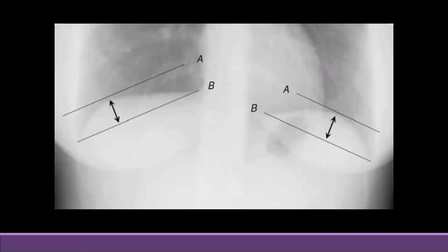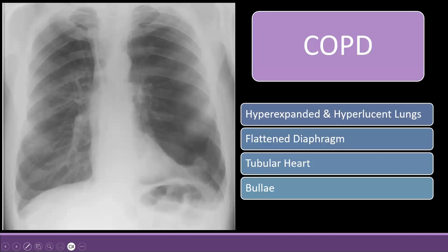To check for flattening of the diaphragm, draw a line from the posterior costophrenic angle to the cardiophrenic angle, then measure the highest point of the diaphragm from this line. If the measurement is less than 1.5 cm, that means the diaphragm has flattened. This is a more sensitive sign of hyperinflation compared to just counting ribs.